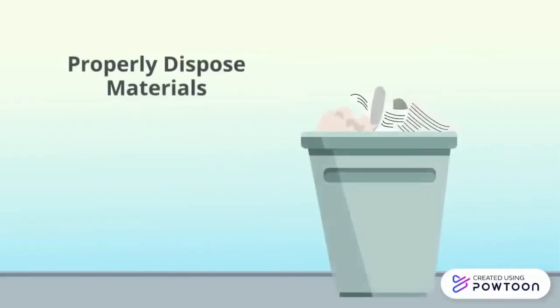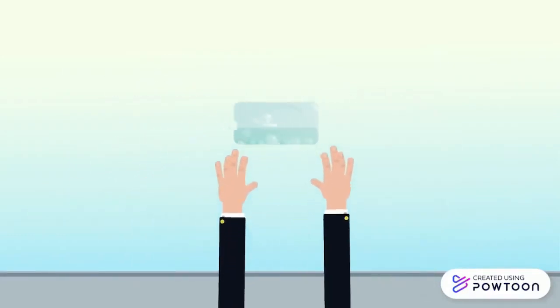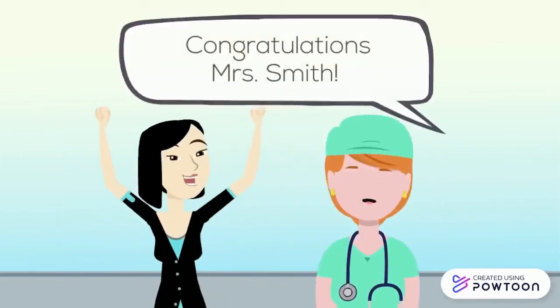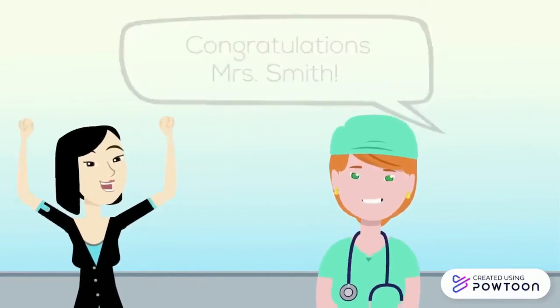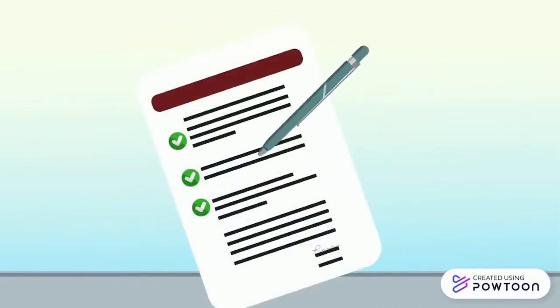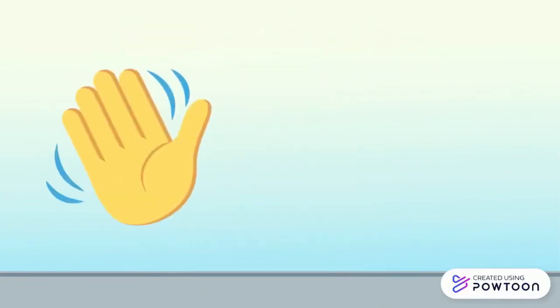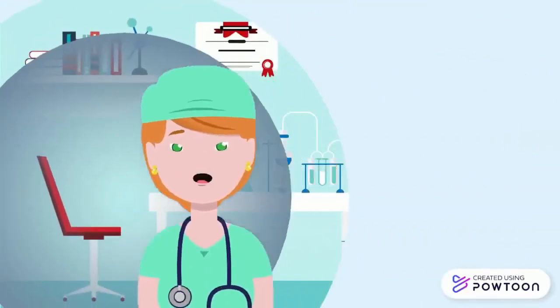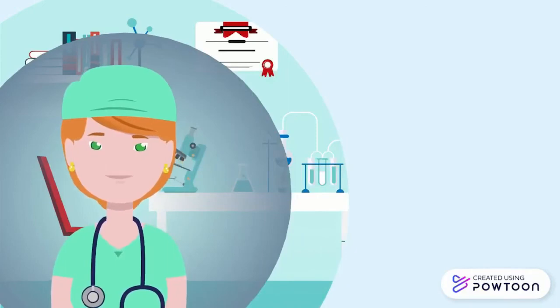After reading its result, remove and properly dispose of all material and perform hand hygiene. Once you're already done with the procedure, you may let your client know its result. Document everything in the client's record and bid goodbye to the client as you finish the appointment. And that's it, a short and sweet procedure of pregnancy test.